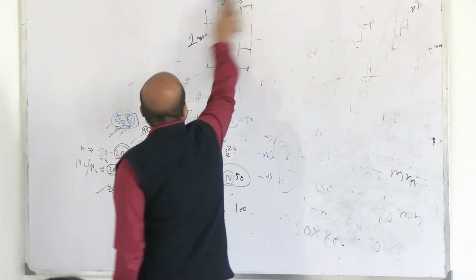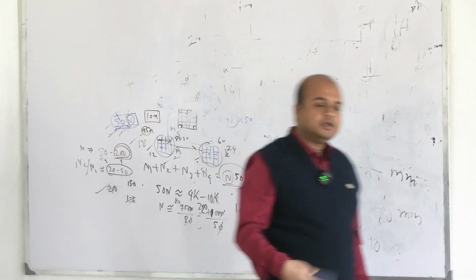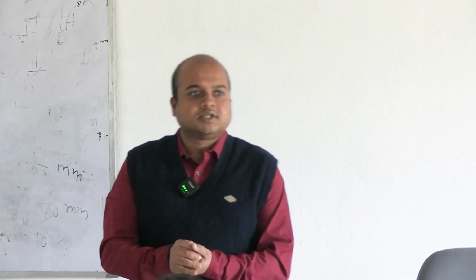Now the rest, there is nothing to actually discuss theoretically. We have discussed the structure of the chamber, we have discussed the calculation. The rest is doing hands-on and practicing. What are the important steps? First is precautions. One is during drawing of the blood by the pipette, there should not be air bubbles. It should be drawn exactly up to 0.5. If you draw it up to 0.8 instead of 0.5, then the dilution factor will change. What will be the dilution factor then? It will be 101 minus 1 by 0.8, not 0.5.